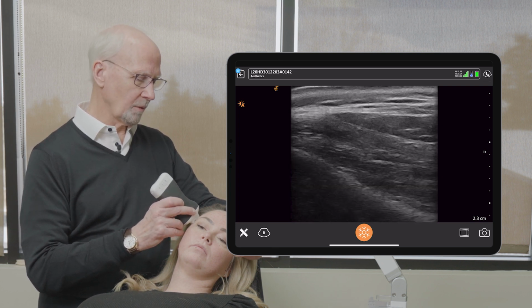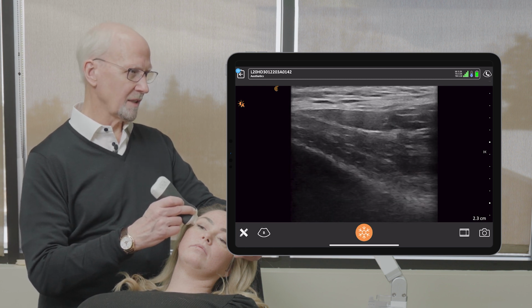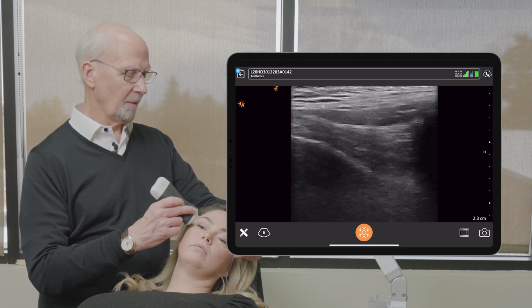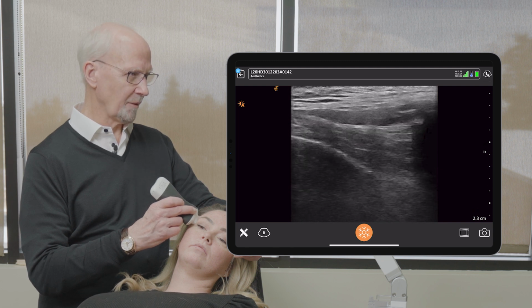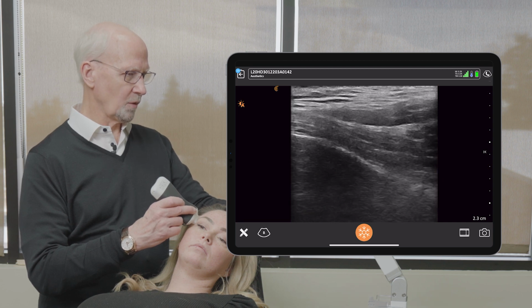One of the areas where we see frequent injections is here, about a centimeter above the lateral aspect of the temple, a centimeter down from the suture line. So a very easy place for us to work.